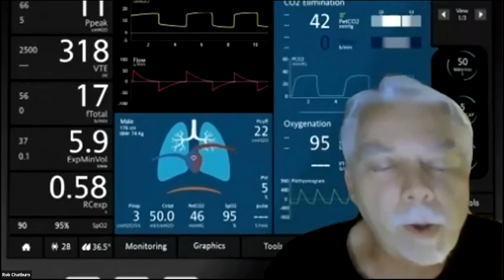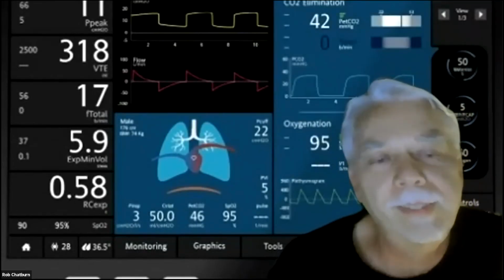Right. So you need to have them spontaneously breathing. I've worked on some of the NAVA signal: sedation, hangover from paralysis, etc. Hugely affects the signal or the brain, and then it becomes null and void. So until we have indeed a probe that we can stick into the medulla oblongata, and it's called Neuralink. Let's go talk to Elon Musk. Yeah. Sorry.